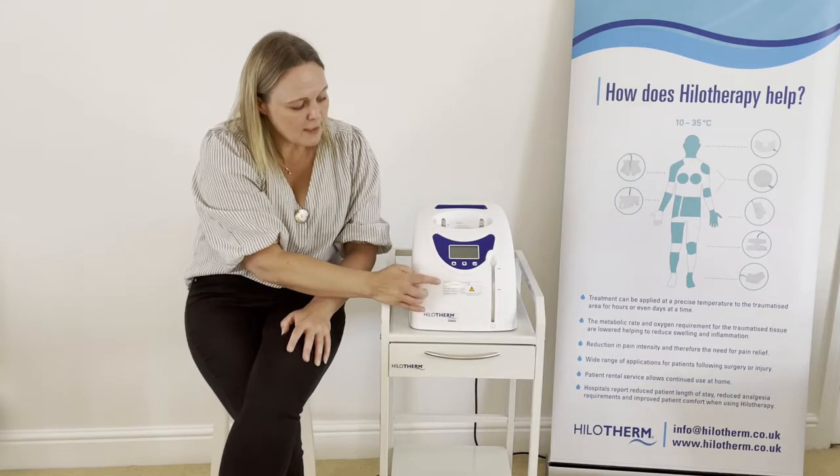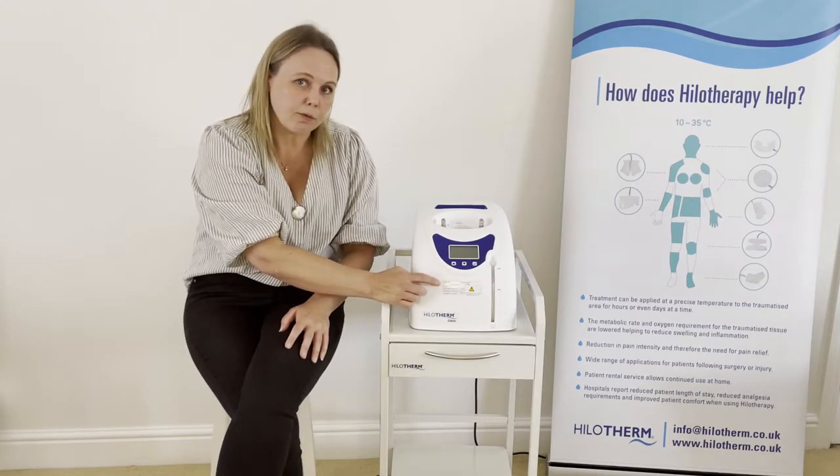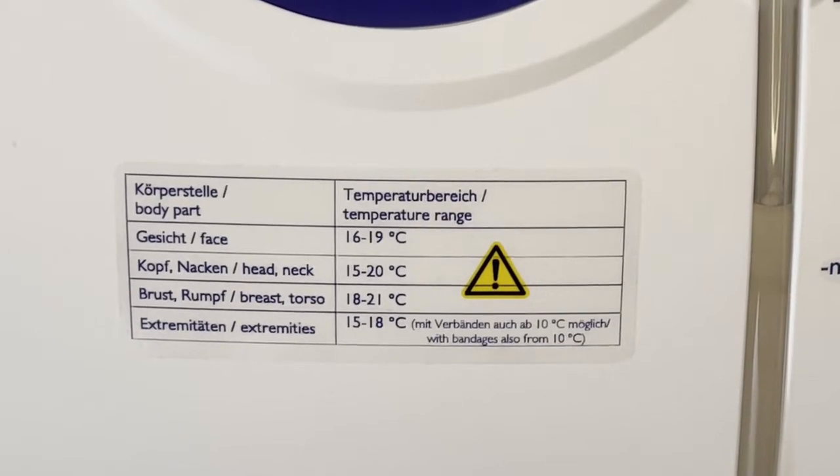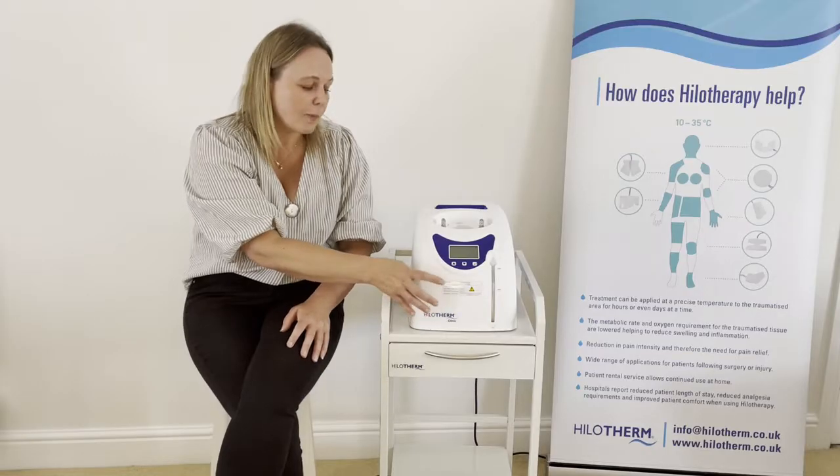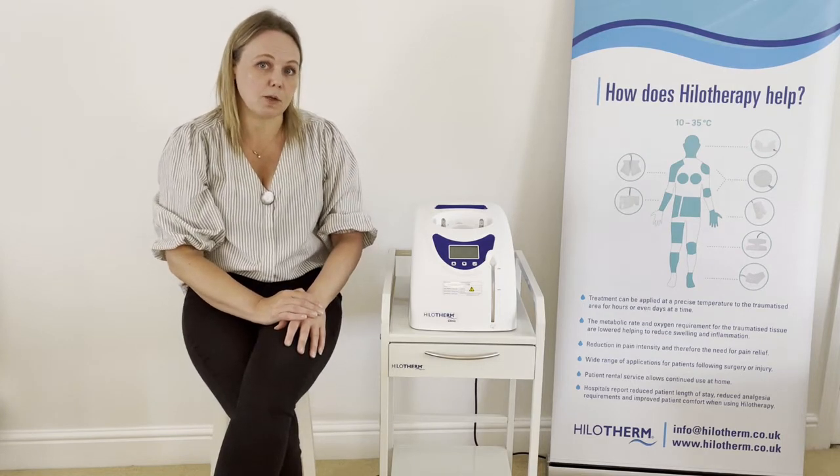All of the recommended temperatures are listed on the front of the device. There is a little chart on the front of each of the Hilotherm clinic devices which shows the recommended temperatures for each part of the face or body.